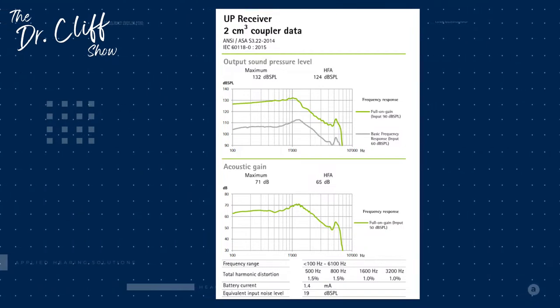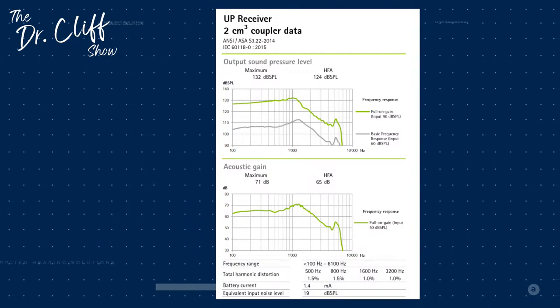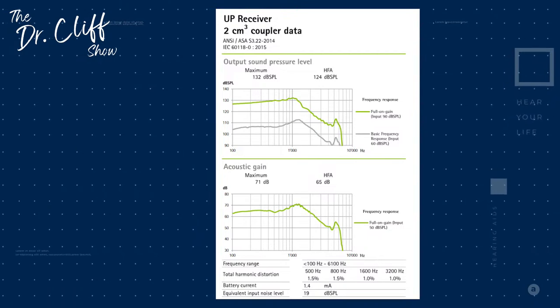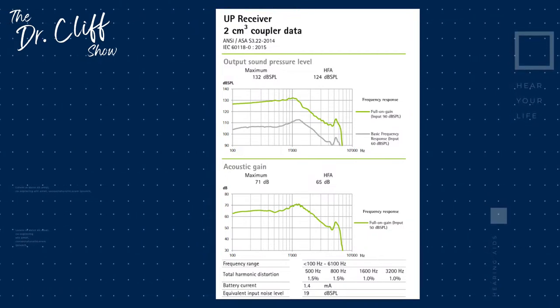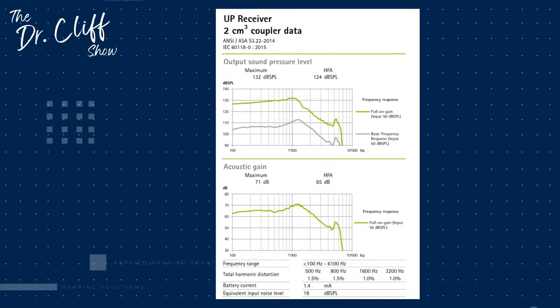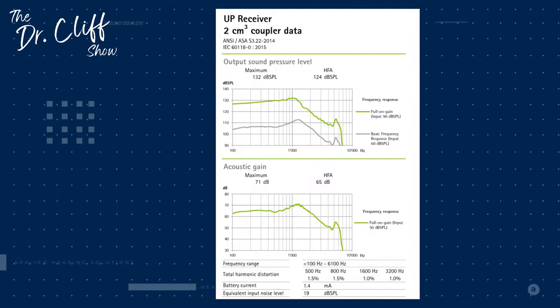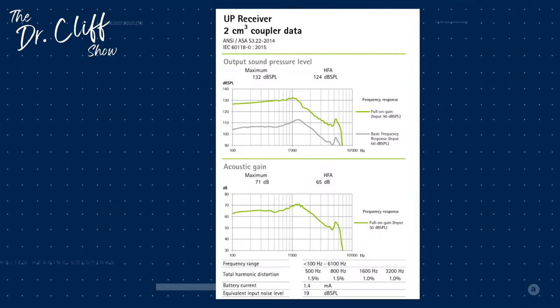As we keep moving further down the graph there, we can see that we're looking at total harmonic distortion. So everybody would have some understanding of what distortion is. It's an unclear sound, basically. But we want to measure distortion levels that, in this case, are right around 1 to 1.5%, depending on the frequency range there, which would be appropriate for this device. And there is a little bit of leeway here. We typically tell patients if you're below 4%, you're good.